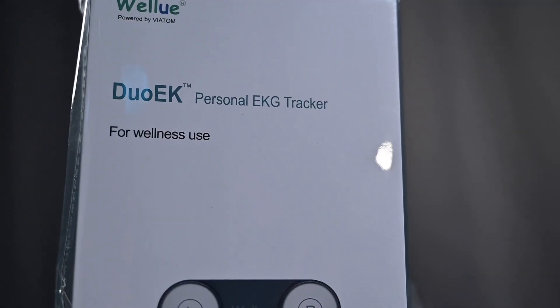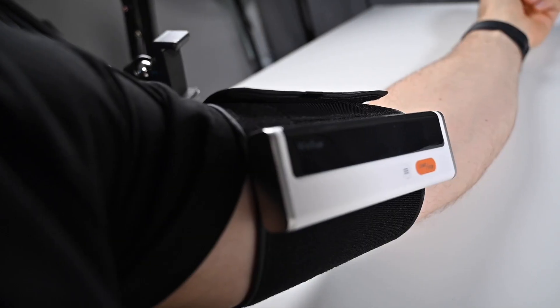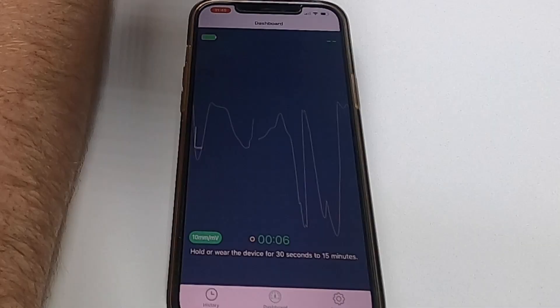I have some at-home medical products: an EKG device, a blood pressure cuff, and of course the well-known pulse oximeter. We're going to test them out, see how well they work, how easy they are to use, and what information you actually get. Let's get into it.